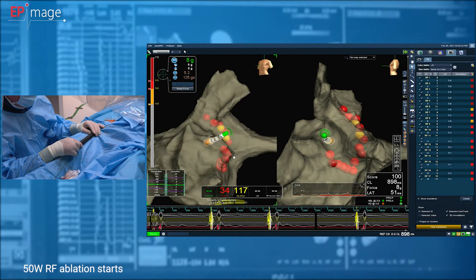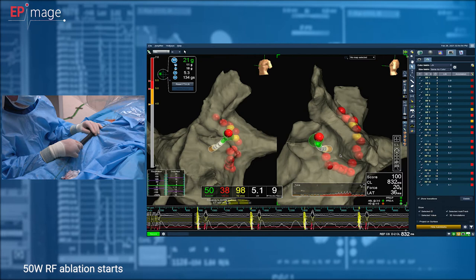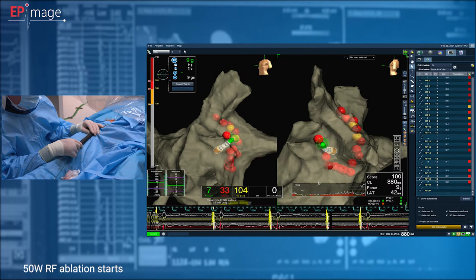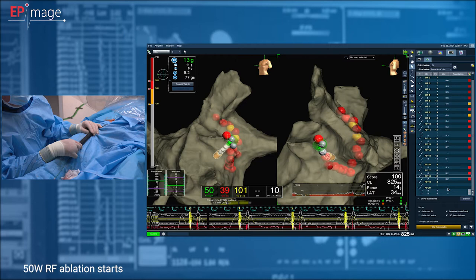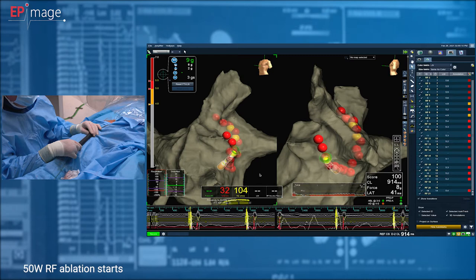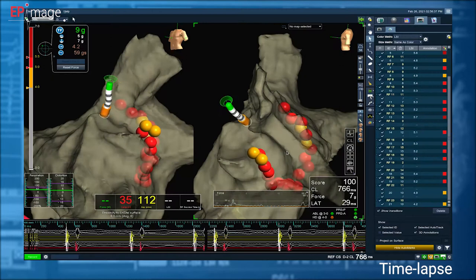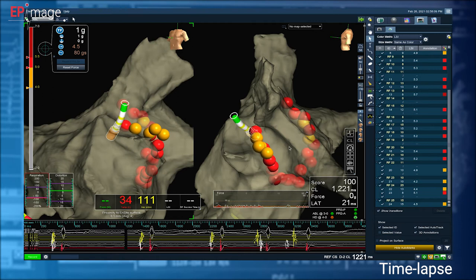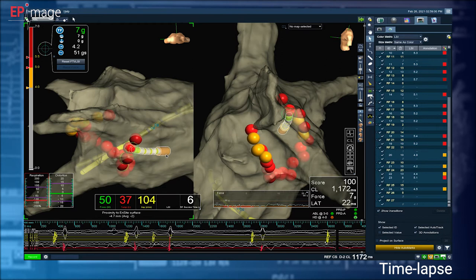So we've already performed the line on the posterior wall, below the left inferior pulmonary vein, and as you see, these are real-time applications. It's not accelerated recording at the moment, so it really doesn't take much time. Almost closed left inferior pulmonary vein isolation. So at the moment we are on the lateral part of the left atrium, just in front of the left pulmonary veins. Now, as you see, the recording has changed. We let you see the rest of the left pulmonary veins isolation in accelerated mode.